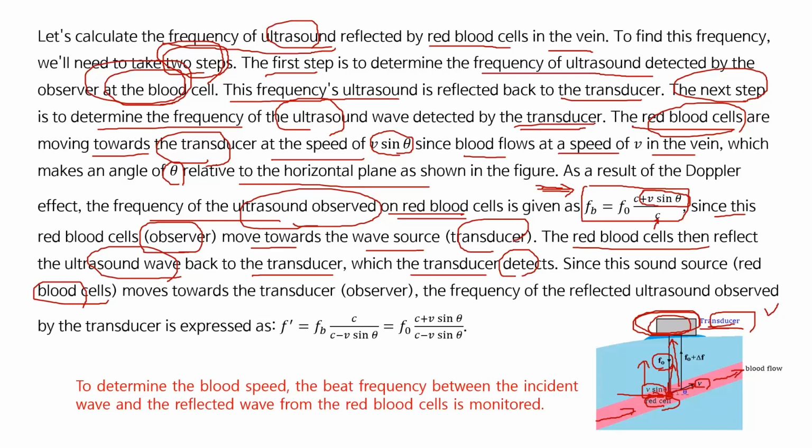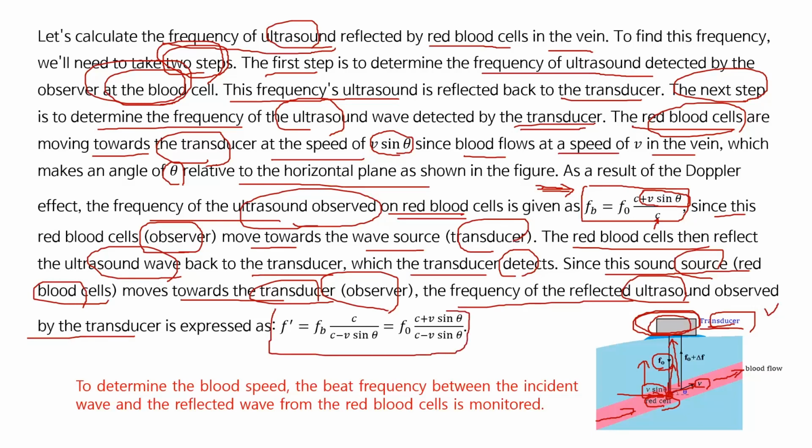So since this sound source, the red blood cell, moves towards the transducer observer, the frequency of the reflected ultrasound observed by the transducer is expressed as this equation.